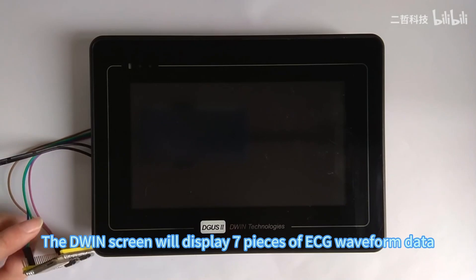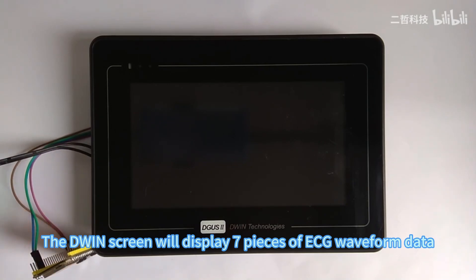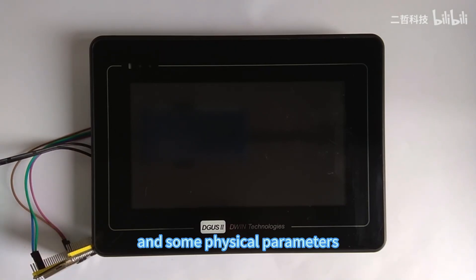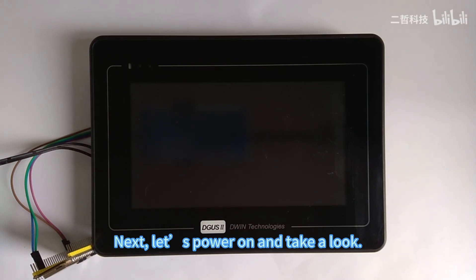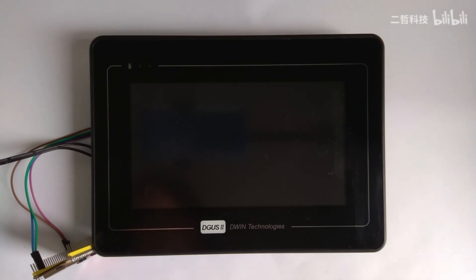It will display seven pieces of ECG waveform data and some physical parameters. Next, let's power on and take a look.